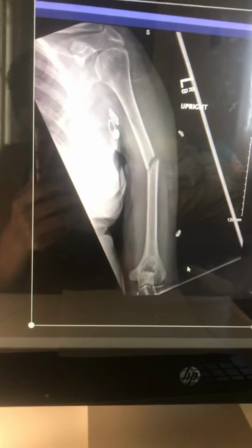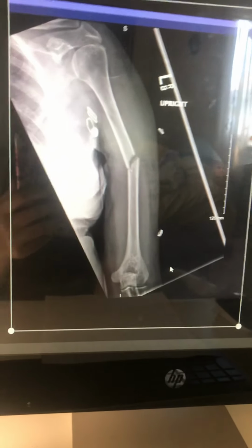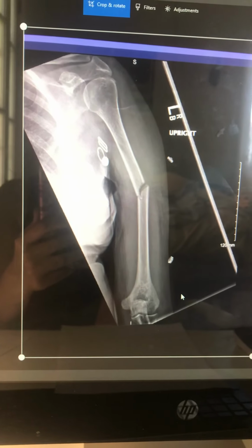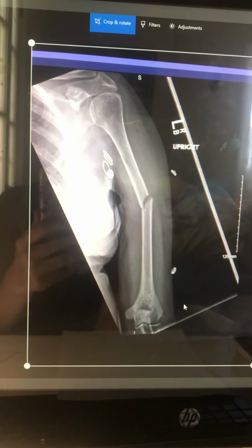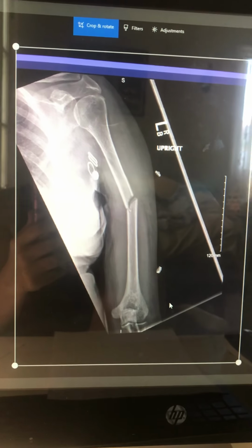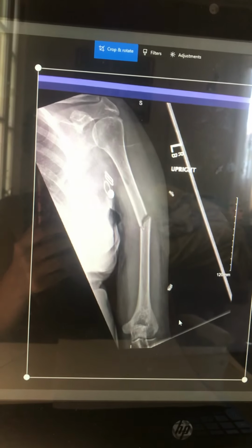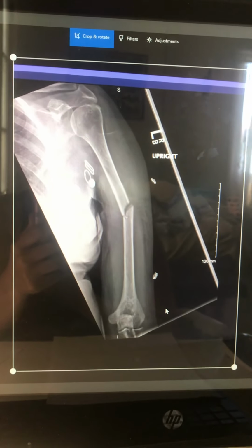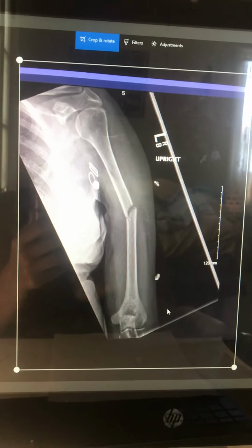There's the soft tissue. Make sure there's nothing in there. It shows swelling and all that. Collimation from side to side was good. It's closely collimated to reduce the dose to the thyroid and the dose to the breast tissue. And the shield was placed around her waist.